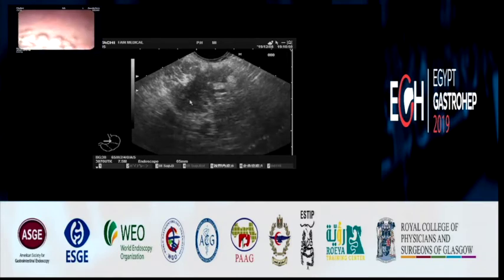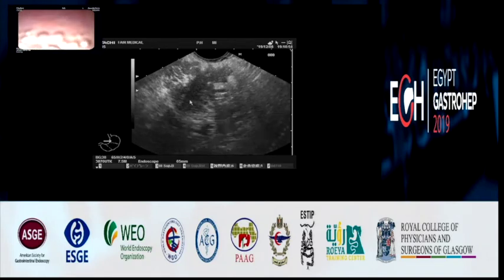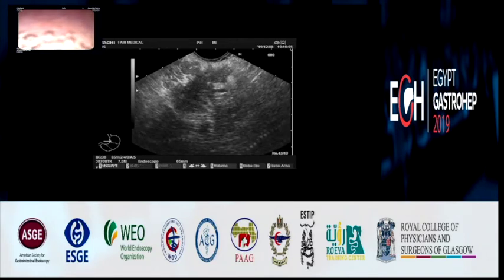Yes, I think it's time for measurement. This is freeze. I think freeze is here. This one. Freeze. Okay. Yes. Don't push.